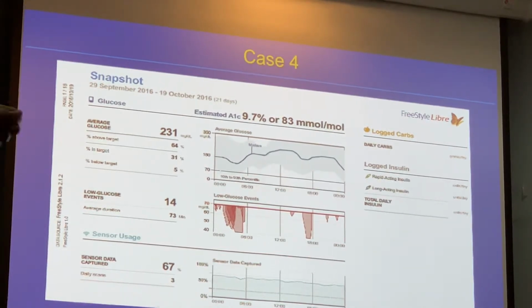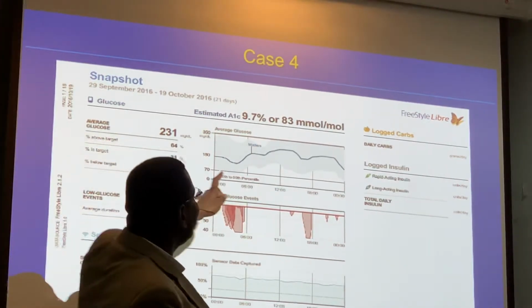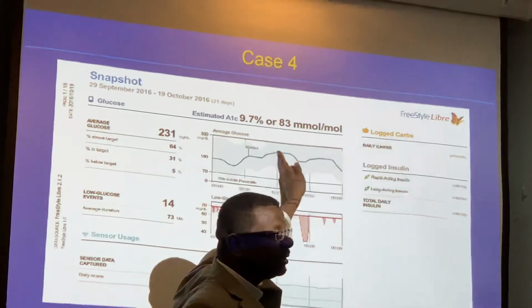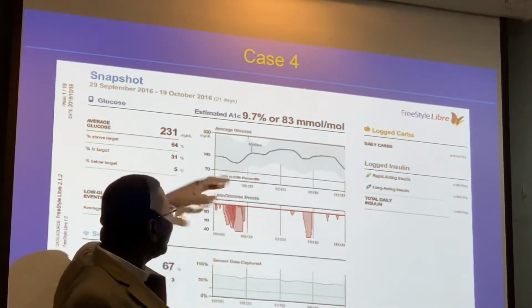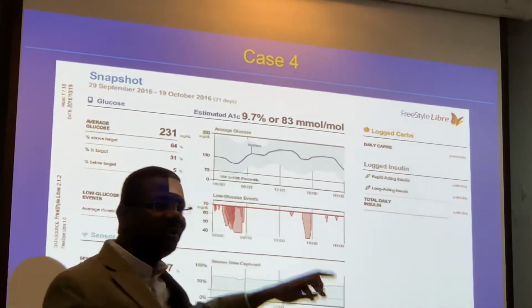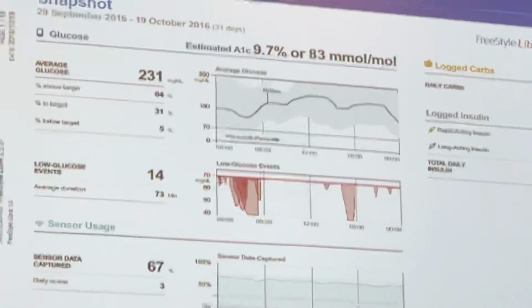And with that, you can address it by adjusting, because that can sometimes be a barrier to improving the control. Because the patient will fear to adjust their insulin because of this. And you can tell them that it is not really your fasting that's making the poor control, but it is mainly these peaks here. So these are the things which are likely to contribute. But to be able to convince the patient, you have to address this to eliminate fasting hypoglycemia, and at the same time convince them to address the peaks, right?